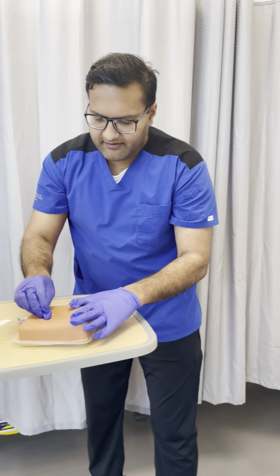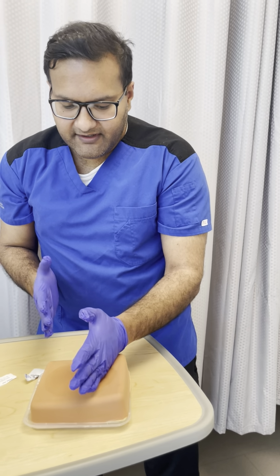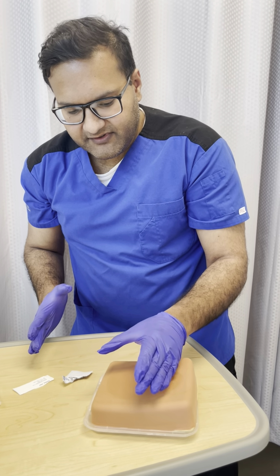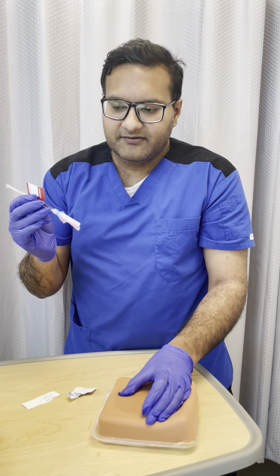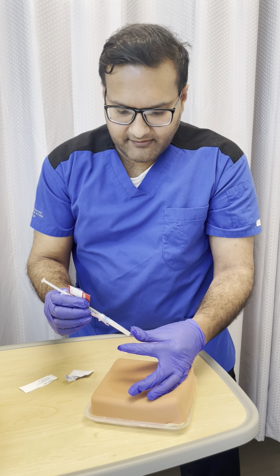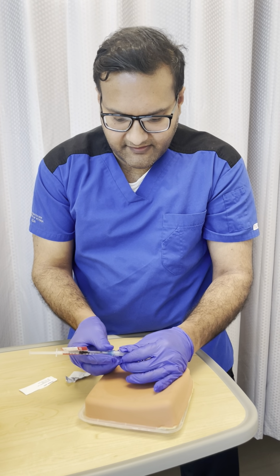I will use the Z-track method technique. And so once the site is dried, I'm going to use my non-dominant hand, which would be my left hand, to pull the skin to the side. And then I'm going to then clench the area. And then I'm going to use my dominant hand to have the injection ready. And with that, I'm going to ensure that the needle is clear.